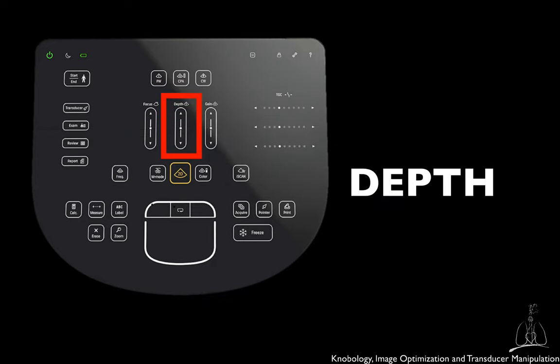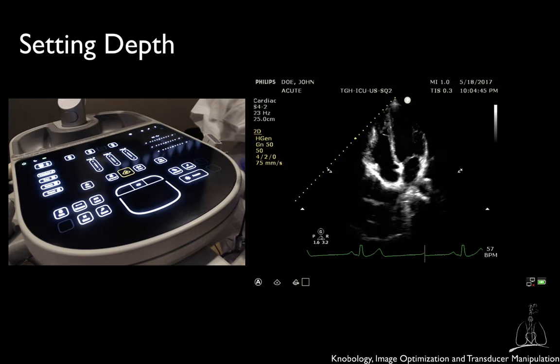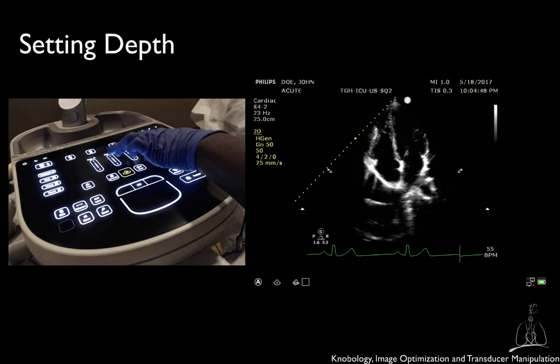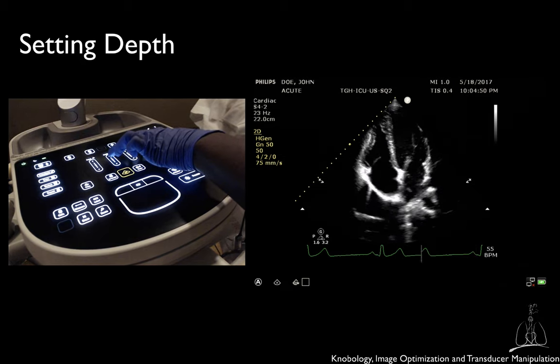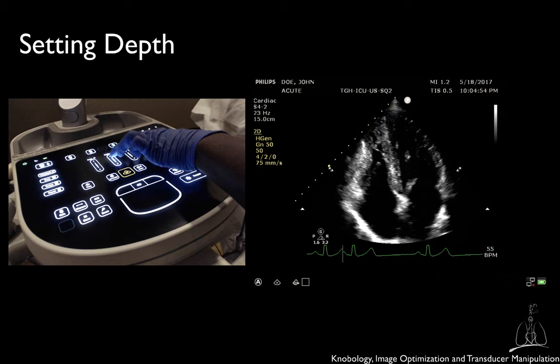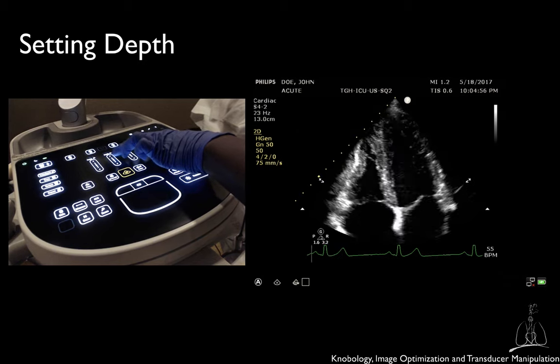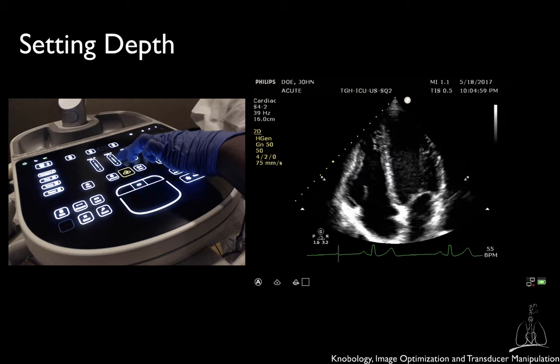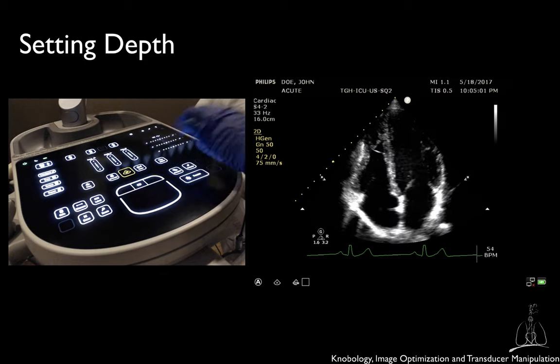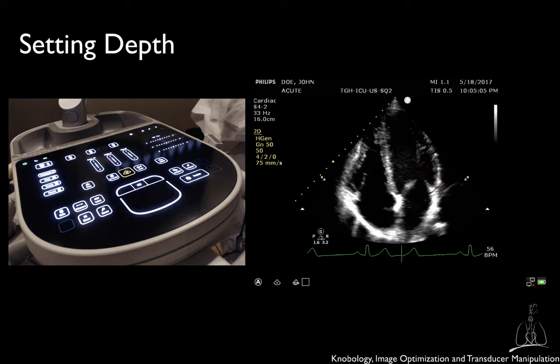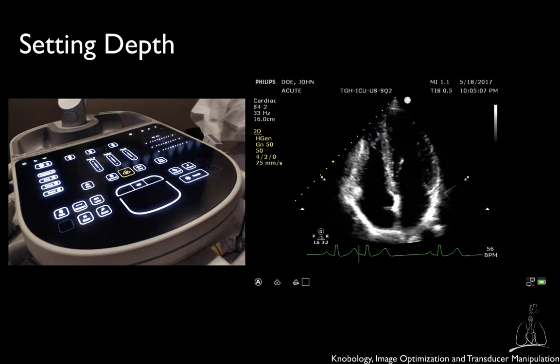You should always adjust the depth according to the structures you want to examine, with the goal of obtaining their complete visualization. Always set the depth to extend approximately 1-2 cm beyond the cardiac structure you are interested in to ensure that they are not cut off. At the same time, if not strictly necessary, do not set too much depth, as excessive depth will affect your temporal resolution and the quality of the images.